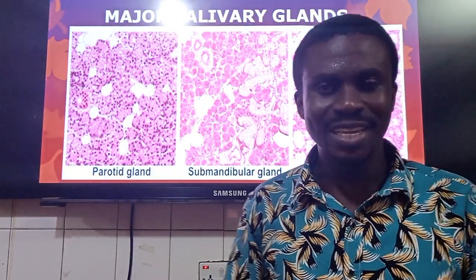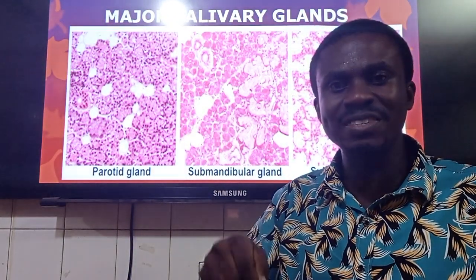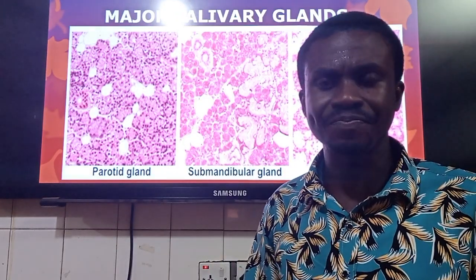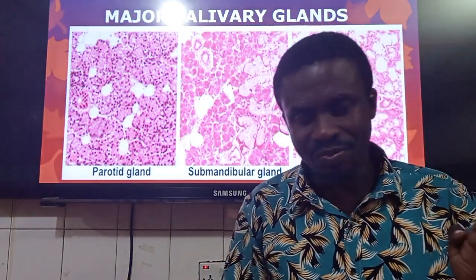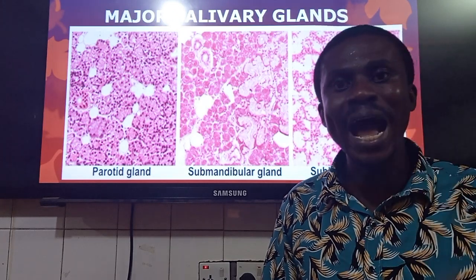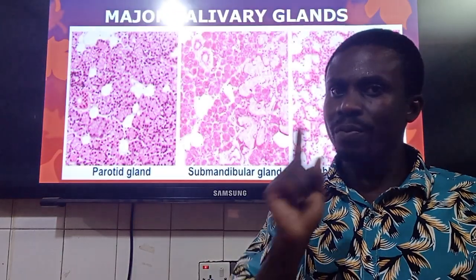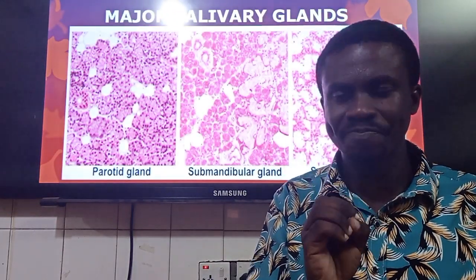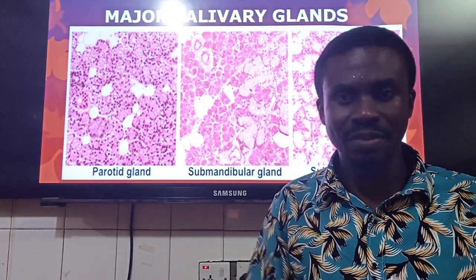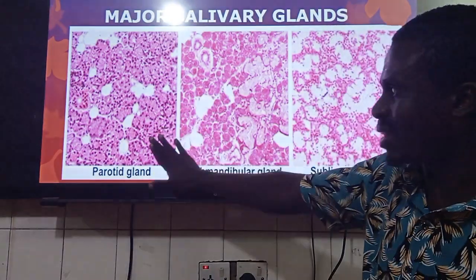And then finally, once they have glands, they have to secrete. So they will have secretory acini forming their secretory unit, and I want you to appreciate that. Now, all of them, regardless of which type we are talking about, will have some serous secretory acini. Mainly, this is what I want you to know: the proportion of the serous secretory acini to any other thing is what will help you to identify them histologically. That's one thing I want you to know.